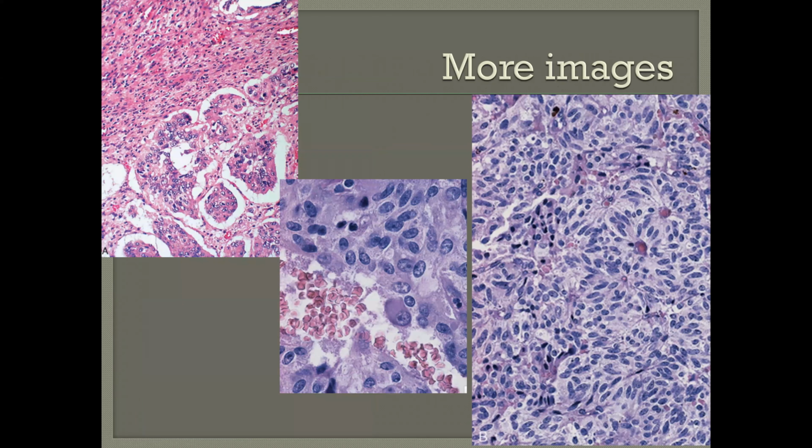Higher magnification, again, the cells will appear somewhat neuroendocrine-like, maybe rounded in nests as you see here, round nuclei, somewhat oval, and a granular, maybe amphophilic type cytoplasm with maybe a few ganglion-like cells. Sometimes the cytoplasm is a little bit more grayish, and rosette type structures can be seen in this lesion as well.